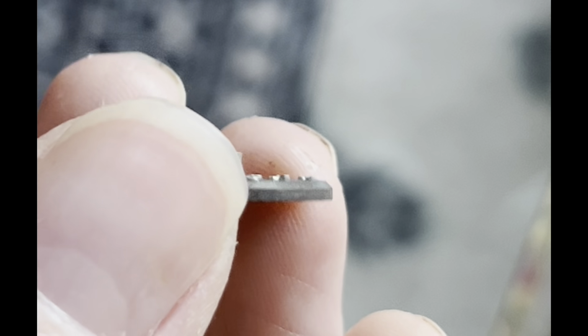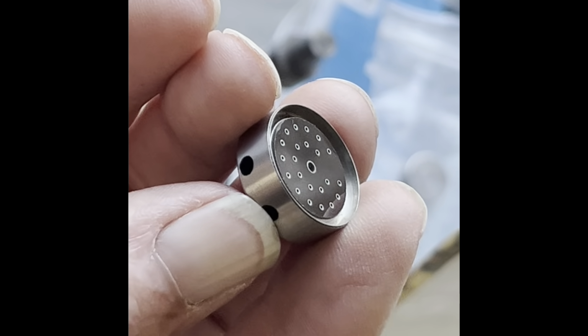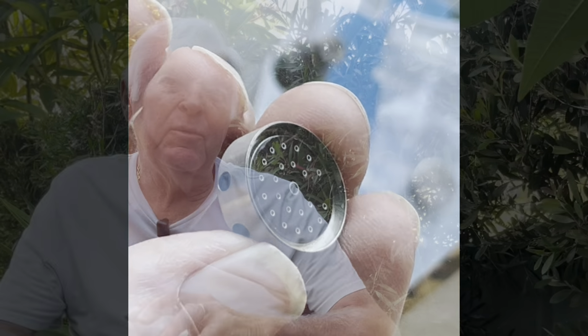And then they bought a machine that they used to lap the surfaces, the one surface. Because there were going to be two of these, one in the bottom part that held all the electronics, and one in the cap that screwed on with the top part, which had the electrode that went into the cochlea, these had to be lapped to a perfect flat finish, which they did.